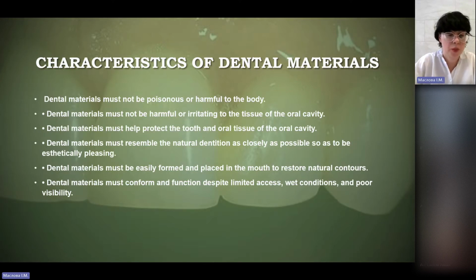It prevents surface and pulpal temperature rise, tissue cracking, and unnecessary removal of healthy surrounding tissue during cavity preparation, unlike the regular turbine drills. Ultrasonic cavity preparation means dental treatment of individual teeth, preserves the tooth substance, and protects adjacent teeth. Development of new dental restorative materials and instruments leads to conserving the natural tooth structures.